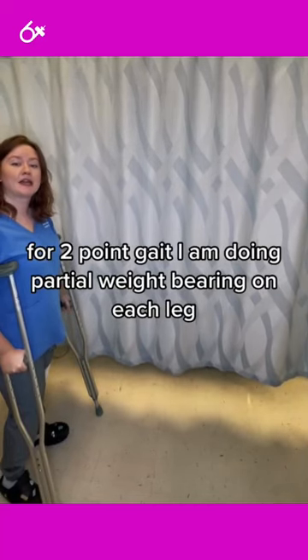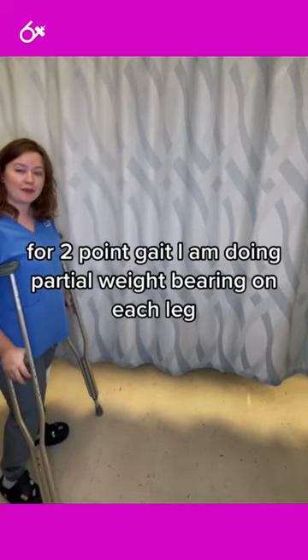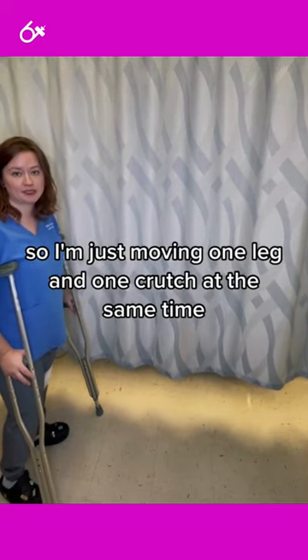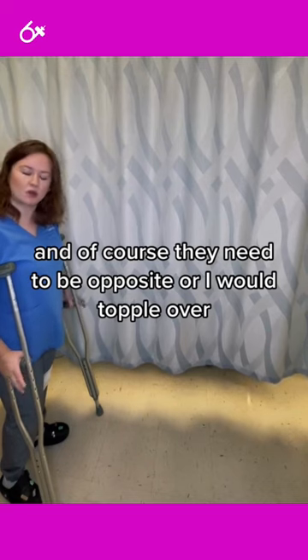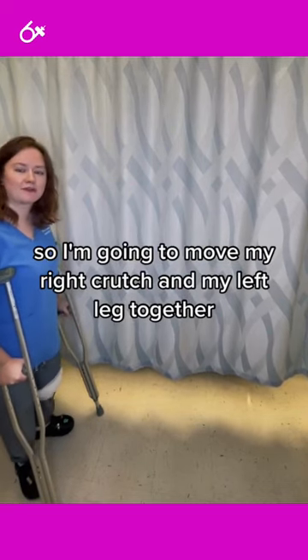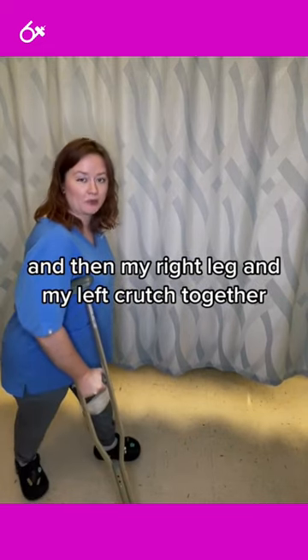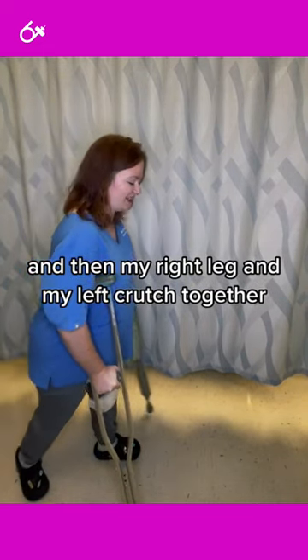For two-point gait, I am doing partial weight-bearing on each leg, so I'm just moving one leg and one crutch at the same time, and of course they need to be opposite or I would topple over. So I'm going to move my right crutch and my left leg together, and then my right leg and my left crutch together.